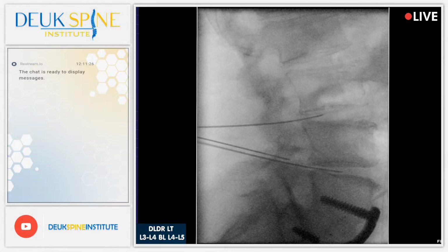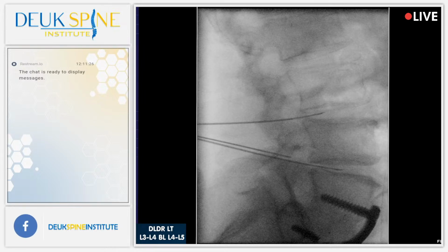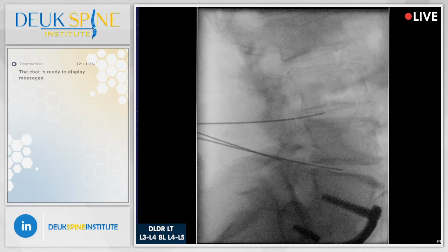All right. So, not yet, not yet. I need to finish L5-S1. Is that my most recent right there? Yes, sir. All right. So I'm looking at my needle at L4-5 on the right side. It's a little bit higher than I want it to be. So I'm going to come in and redirect and go a little bit lower. Shot. That's better.